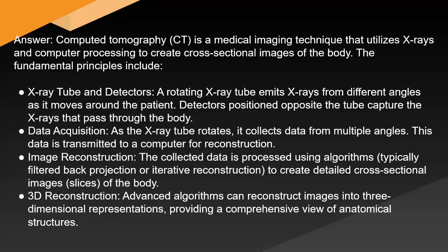Image reconstruction: the collected data is processed using algorithms, typically filtered back projection or iterative reconstruction, to create detailed cross-sectional images, slices of the body. 3D reconstruction: advanced algorithms can reconstruct images into three-dimensional representations, providing a comprehensive view of anatomical structures.